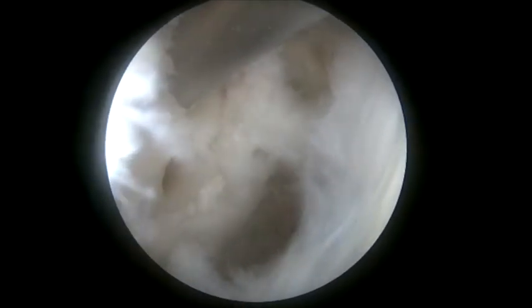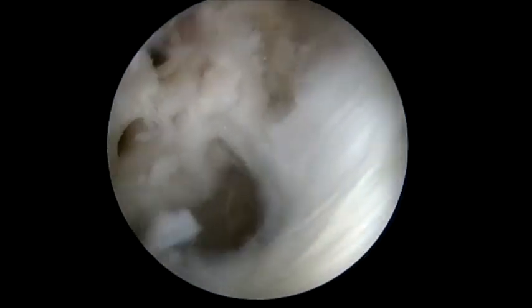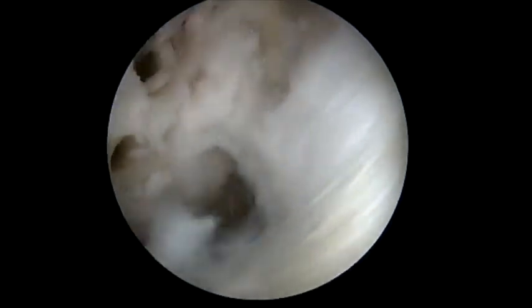Following this, we place a 3.9 corkscrew knotless anchor into the shaft. You can see we've decorticated to increase the potential healing potential.